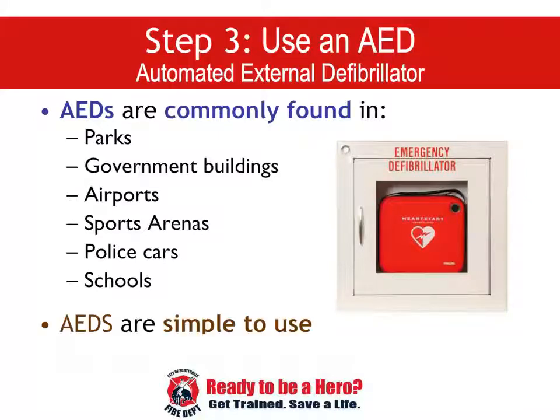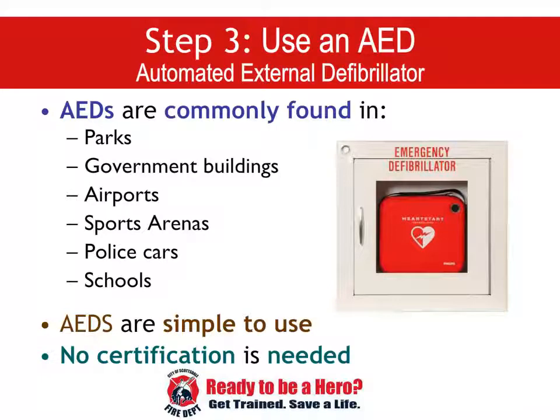Anyone can use an AED. You don't have to have a certification. They've made them easy for the public to use. You should be able to pick up any AED and be able to use it even without specific training. There are pictures. The machine talks to you. And there are about 15 different languages in the instructions if you want to read them.